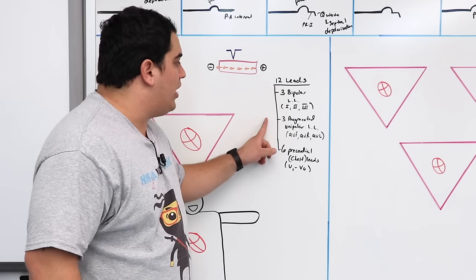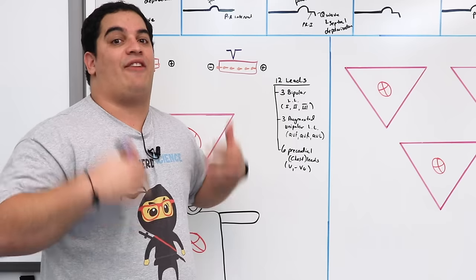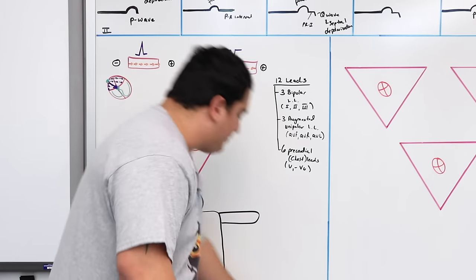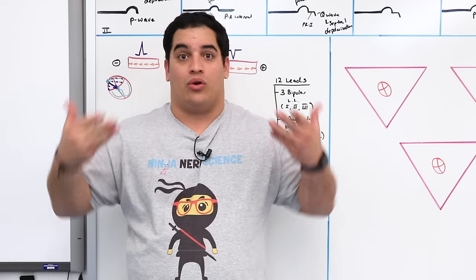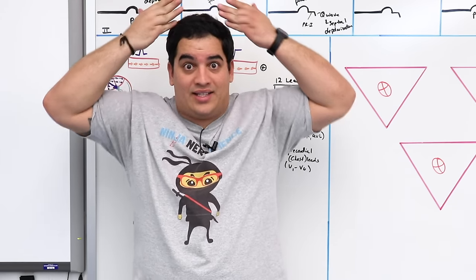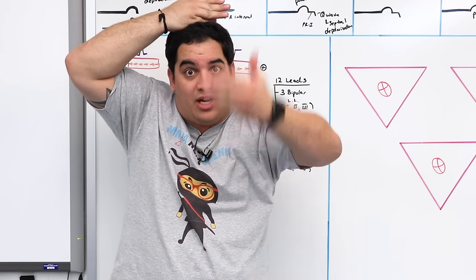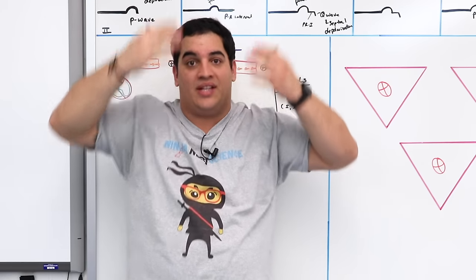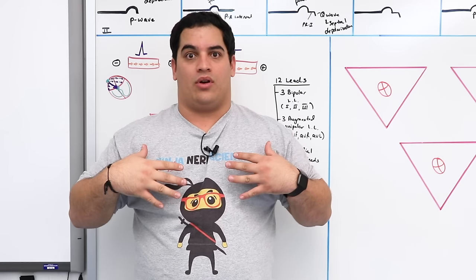The bipolar and the augmented unipolar limb leads look at the heart in a frontal plane. A frontal plane is also called coronal. So in other words, you're taking a slice of me like this, slicing me into an anterior and posterior piece, okay? So an anterior and posterior piece is a frontal plane. That's how these are looking at the heart, okay?